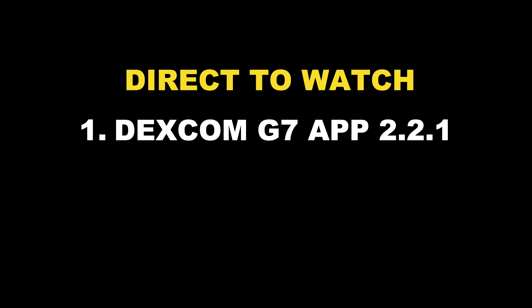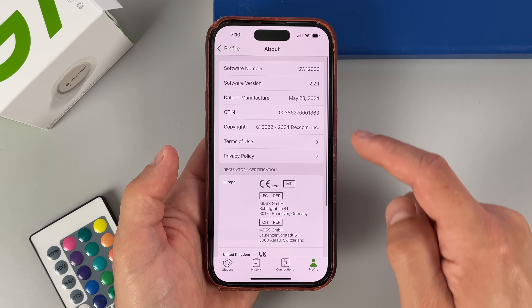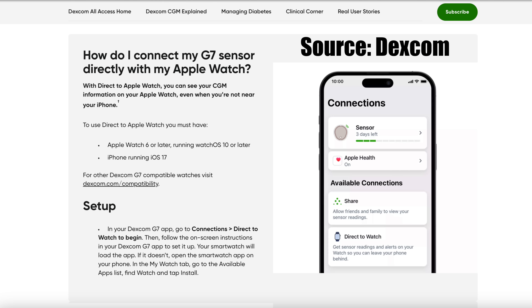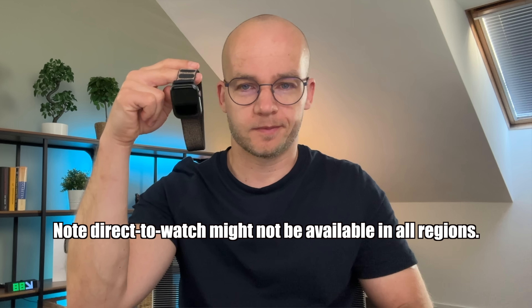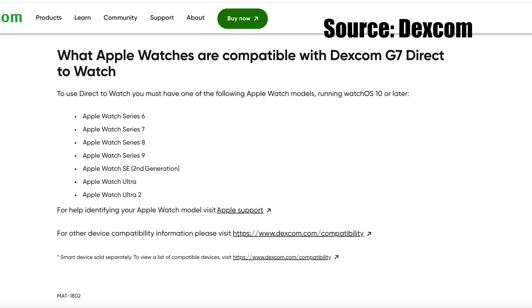Before we all get too excited, there are several things you need for direct to watch to work. First of all, you need Dexcom G7 app version 2.2.1 or later — so go to settings, check what version you currently have and update if needed. Right now, direct to watch only works with Apple. You need Apple Watch 6 or later with watchOS 10 or later, and you need an iPhone running iOS 17 or later. To connect the G7 sensor directly with your Apple Watch, open the G7 phone app, go to Connections, then Direct to Watch, and follow the on-screen instructions.